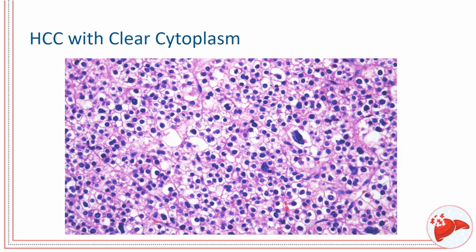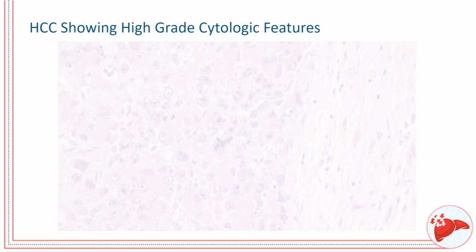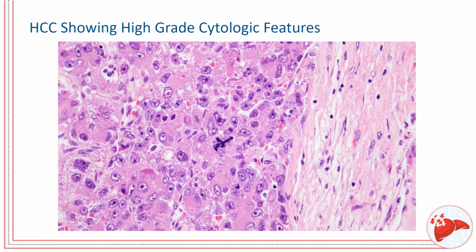This one perhaps more convincing than the previous for being poorly differentiated. But again, another hepatocellular carcinoma. You can see that there's some large pleomorphic cells with bizarre nuclei away to the right-hand side of the field, and in this particular case having some clear cytoplasm. But like the previous, showing convincing expression of all hepatocellular markers and a lack of expression of markers of other origins. And the third example is a tumor here with more anisonucleosis, and so the pleomorphism from cell to cell is perhaps more pronounced in this case, with a bizarre atypical mitosis almost in the center of the field.